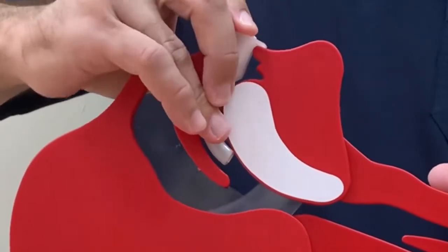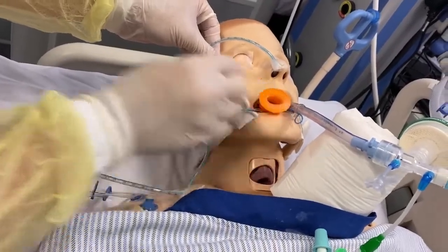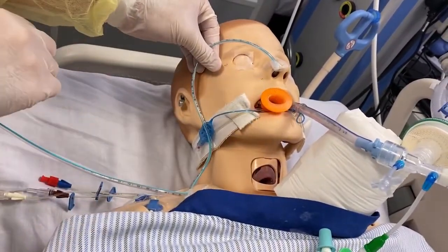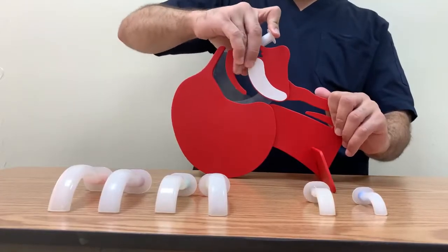The oropharyngeal airway is used for patients who are unconscious and do not have a gag reflex, so they will not vomit. You can also use the oropharyngeal airway for the intubated patient to prevent biting of the tube.